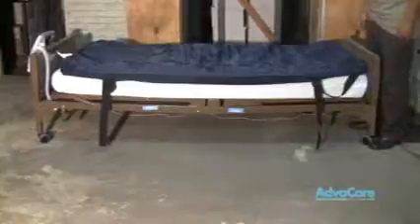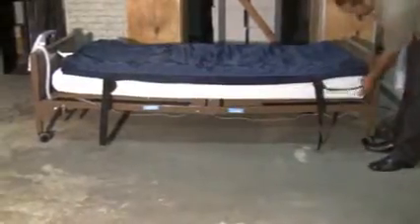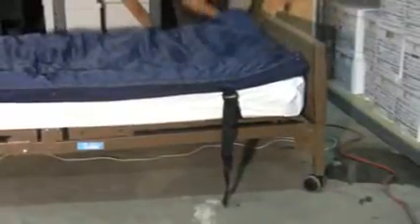The Plexus 2200 overlay is a mattress overlay system which should be applied over any regular spring mattress. When applying a Plexus 2200 overlay, you will have straps which go over each of the four corners. You would want to ensure that all the straps are tightly secured around the mattress for patient safety.